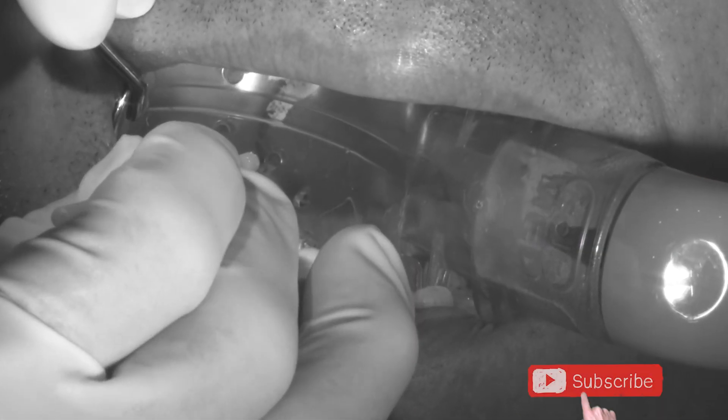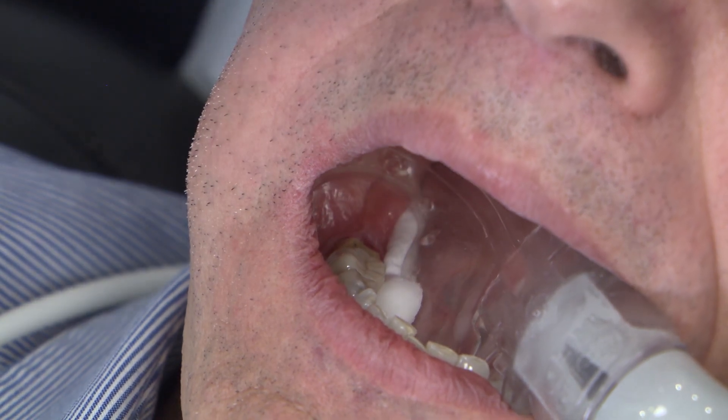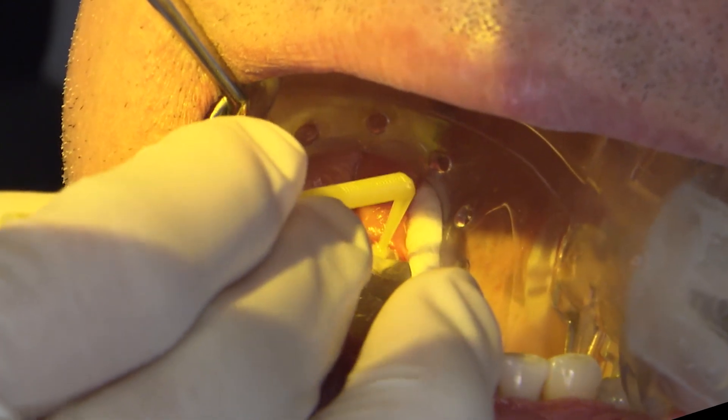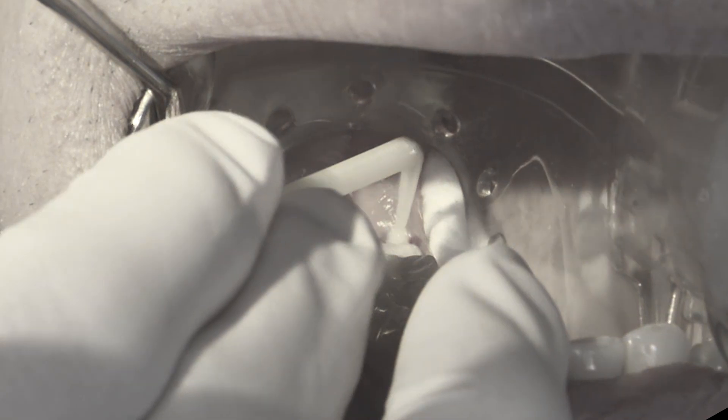We're going to really scrub this into the prep — that's also one of the keys. If you are using a bonding agent on your tooth, whether it's for direct or indirect restorations, scrubbing this in will help improve its efficacy because it allows the resin monomers within the bonding agent to flow into those open dentinal tubules.